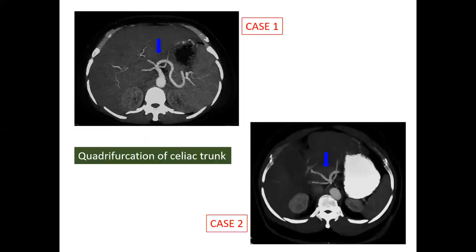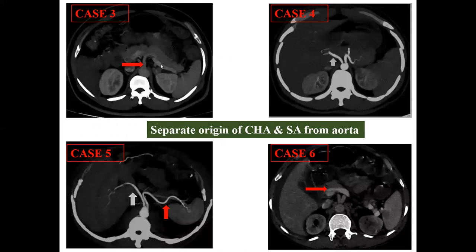Now we will see the cases. Cases 1 and 2 show quadrification of the celiac trunk. Cases 3, 4, 5, and 6 show the splenic artery and hepatic artery with separate origins from the aorta. Post-contrast MIP CT images in the transaxial section show the separate origin of the common hepatic artery directly from the aorta at the same level. The celiac axis with congenital narrowing and an elephant trunk appearance is seen in case 6, where the common hepatic and splenic arteries have a common trunk.